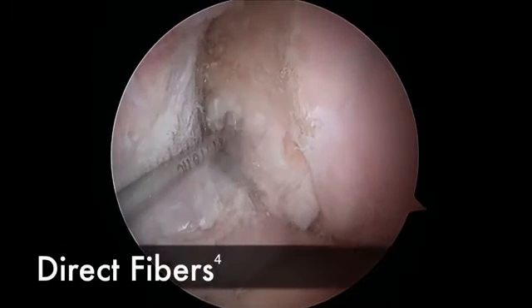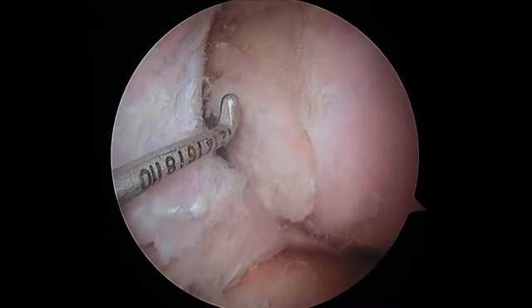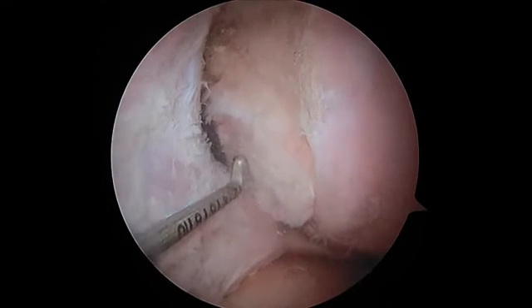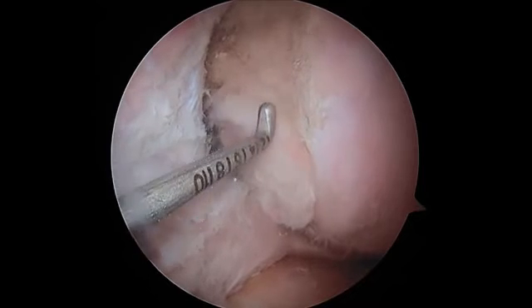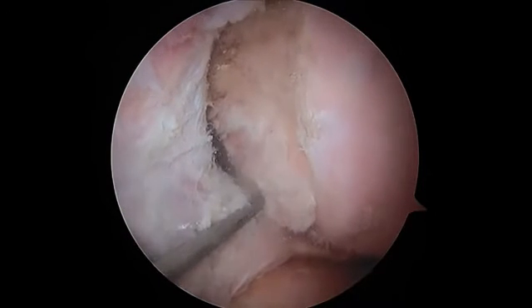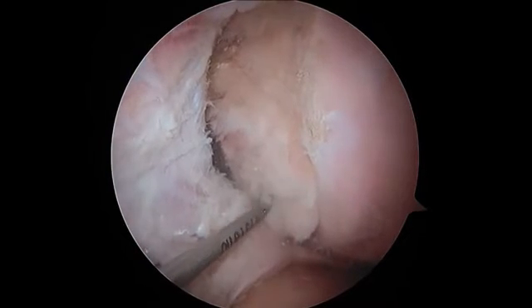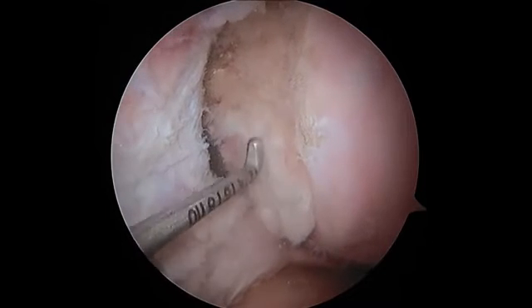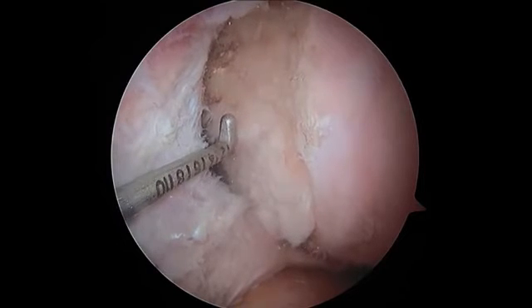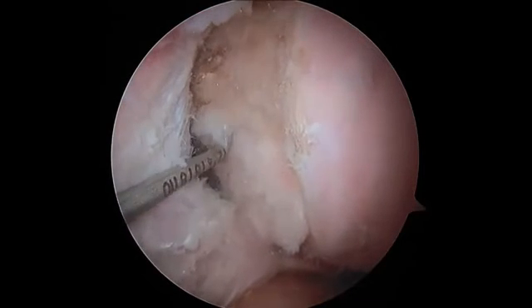The D is for the direct fibers. Now this is a histologic description of the footprint. Sasaki has pointed out that there are direct and indirect fibers histologically in the ACL footprint. The direct fibers are higher or more anterior along the intercondylar ridge, and the low fibers are more posterior down here along the posterior femoral cartilage. Now you can't discern the indirect versus the direct fibers macroscopically. This is a histologic classification, but again, indirect fibers are in this region and the direct fibers are in this region down here.